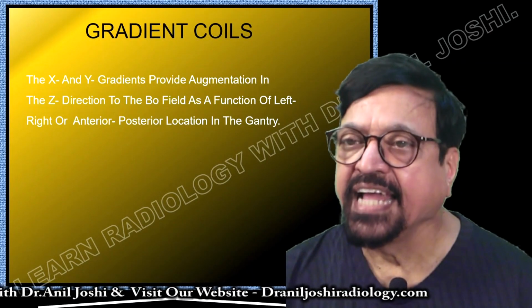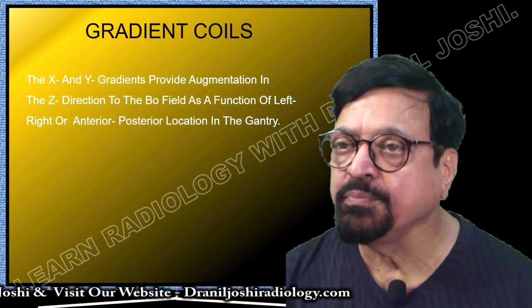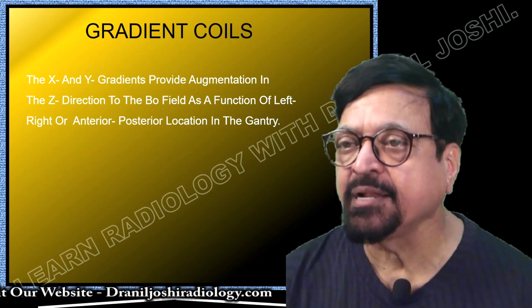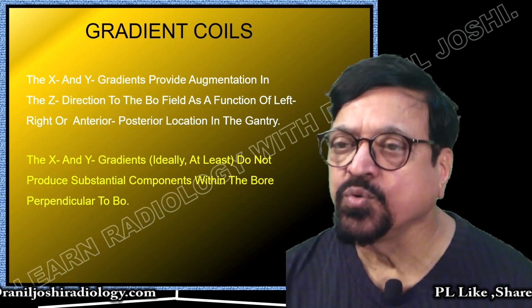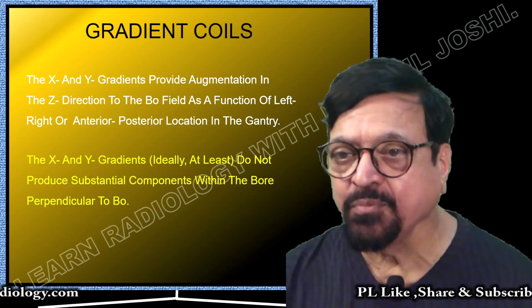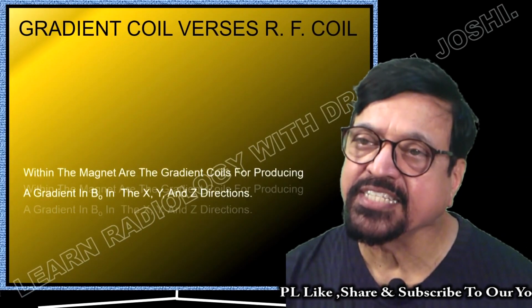Continuing, the X and Y gradients provide variation in the Z direction component of the B0 field as a function of the left-right or anterior-posterior location in the gantry. The X and Y gradients, ideally at least, do not produce a substantial component within the bore perpendicular to B0, that is perpendicular to the patient's axis.